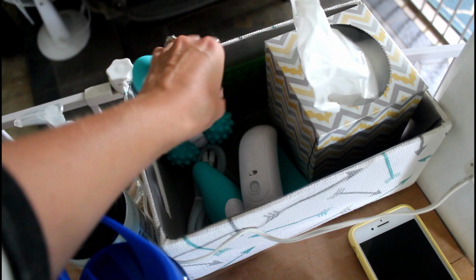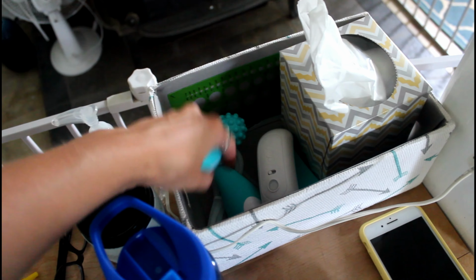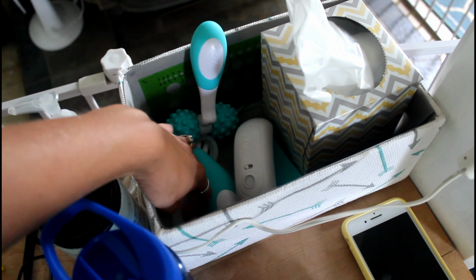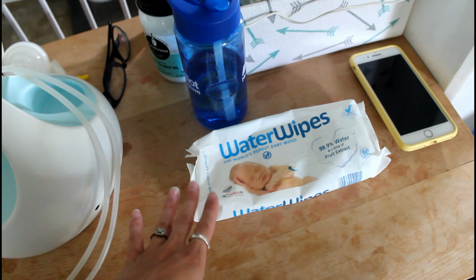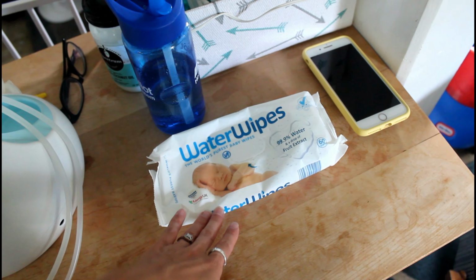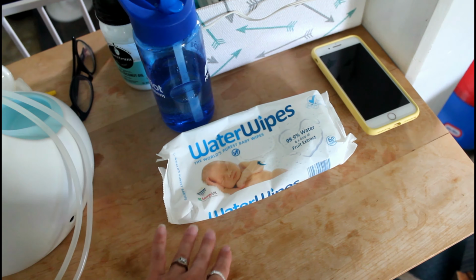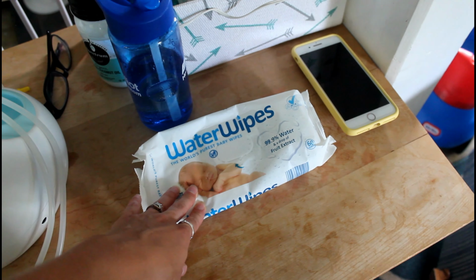And then back here is my flange measurer, just in case I'm like, oh my god, what's going on, my nipple has grown or something. This is just some more tubing. I do use wet wipes to wash my breasts after every pump session. You don't have to do this if you have a full-term baby, but because I am pumping for NICU babies, I need to be really sterile and clean, so I always use these wipes for that.